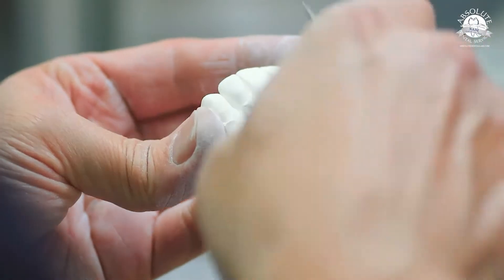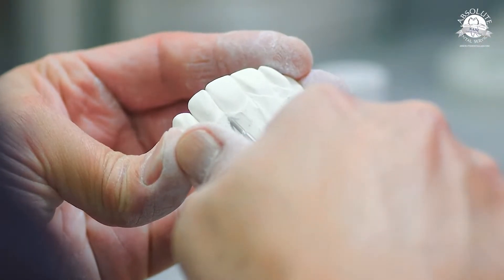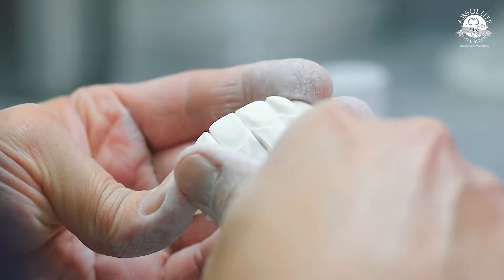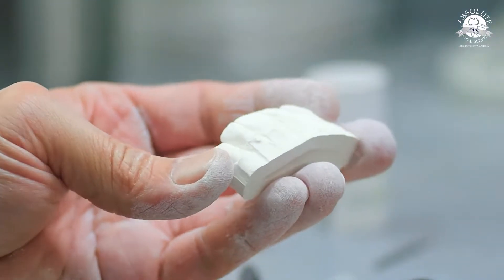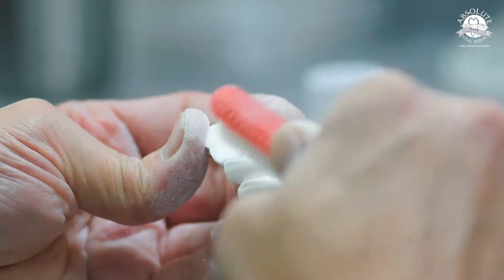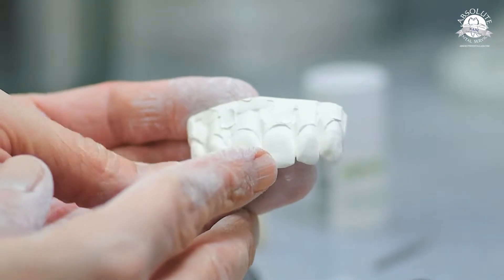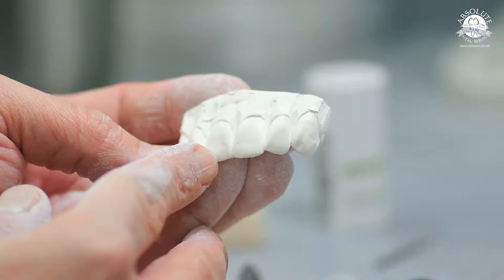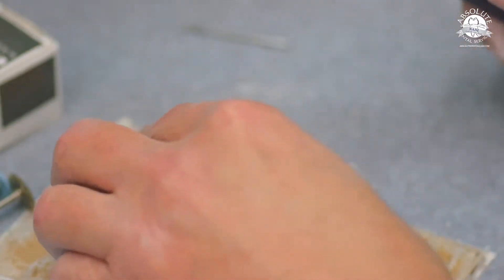Now with the flame carbide, look at how deep I'm digging in there — I'm really opening those up and accentuating them as much as possible. Dust off your zirconia frequently so you can see what you've done. We're going to leave the left-hand side untouched and concentrate on the right, so you can see the difference between the finished side and the unfinished side.